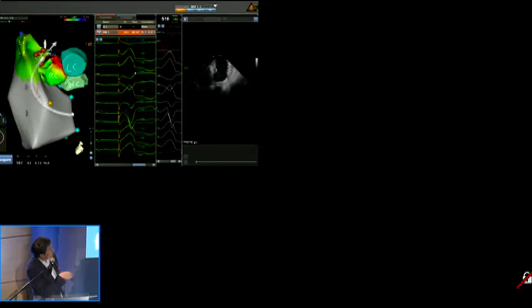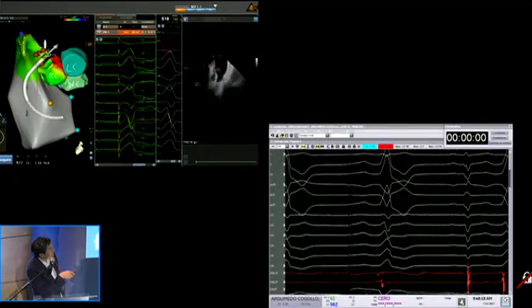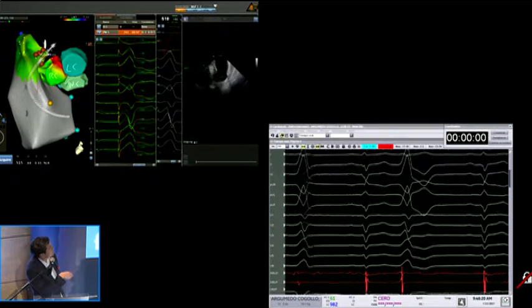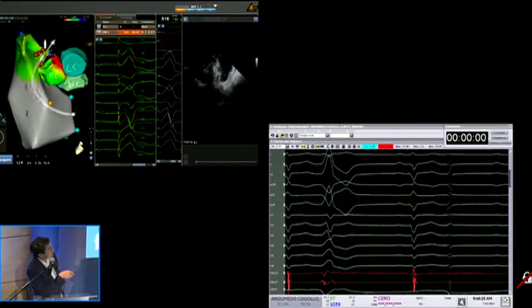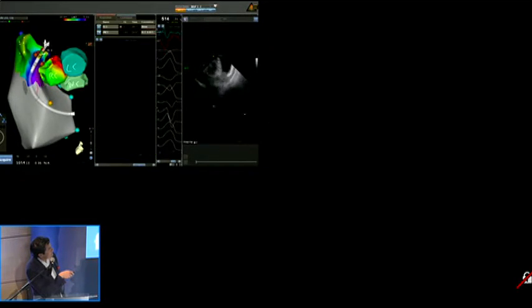Is it this one? Are you sure? No, that's not it. This is the older one. Take the point again, for the fifth time.